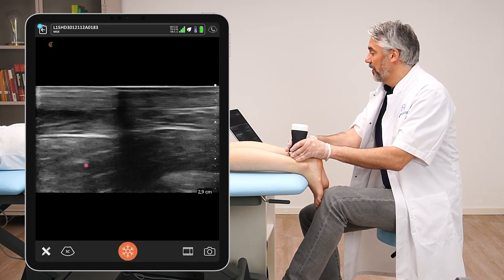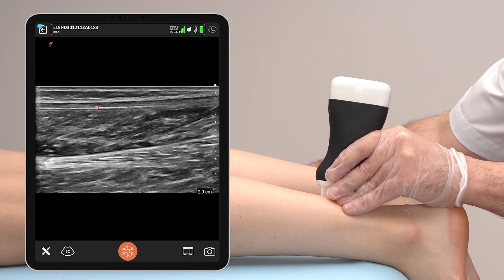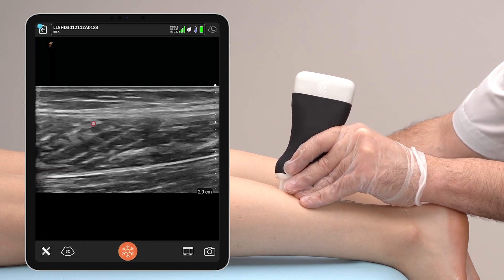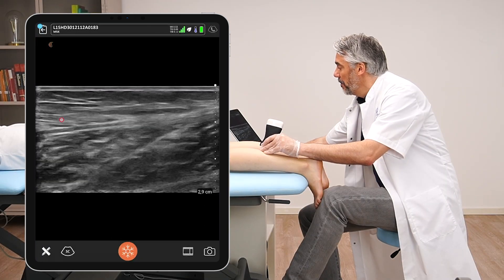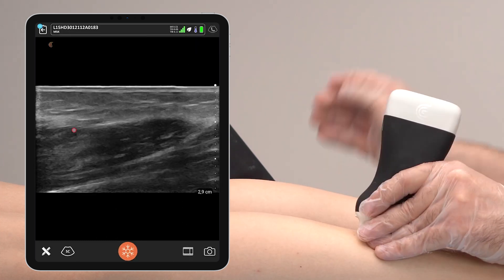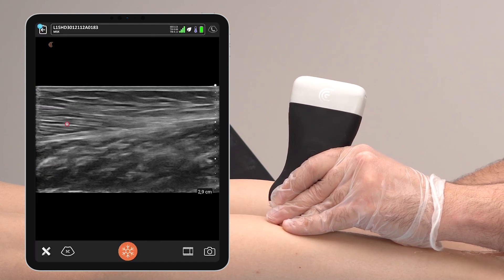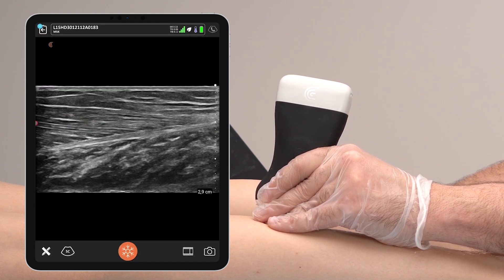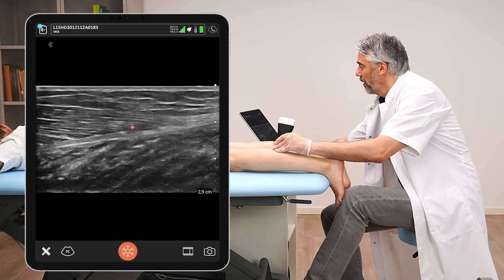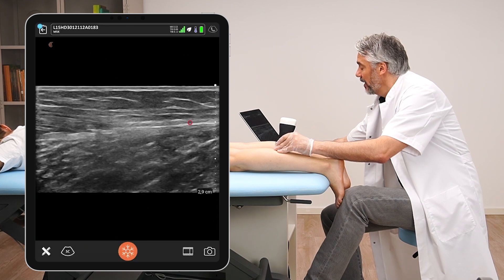We can follow the soleus and the gastrocnemius aponeurosis proximally. This is the soleus muscle, and this is the gastrocnemius aponeurosis. Continuing proximally, you can see a muscle becoming larger — this is the gastrocnemius muscle. We can see the fibers of the medial gastrocnemius muscle inserting into this epimysium layer. This is the musculotendinous junction of the gastrocnemius, a spot where lots of muscle tearing occurs, and then it flows back into the gastrocnemius aponeurosis.